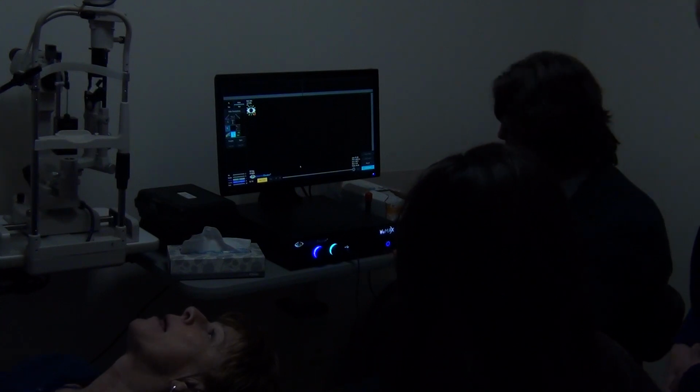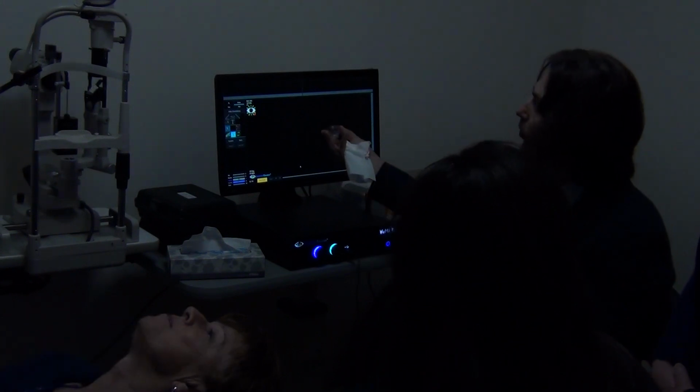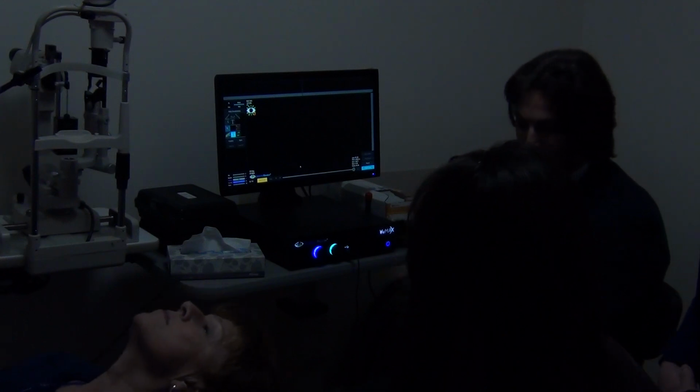The unit also will send you a sound if you're too close to the cornea. I've heard that. Yeah, like beep beep beep beep beep. And of course, the higher the resolution of the image, the closer you are to the eye.